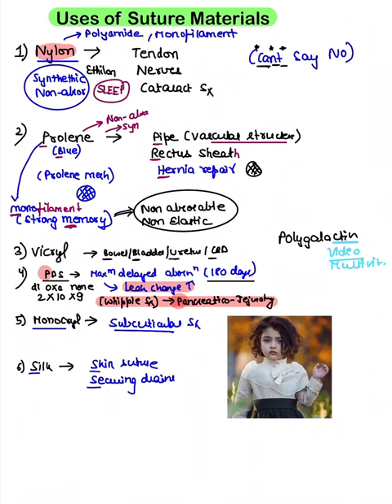Now coming on to Monocryl. This Monocryl is known as poliglecaprone. This comes under absorbable suture, but this is a synthetic suture. So remember, Monocryl is like a mass substitute, that is subcuticular. People think that I am a substitute and then they cry in the corner. That is me substitute, that is subcuticular. And this Monocryl was orange in color.